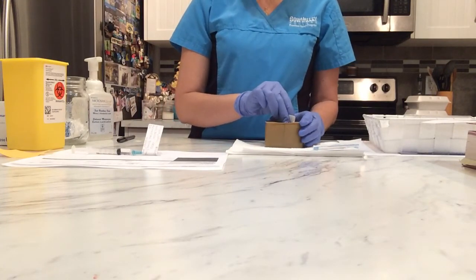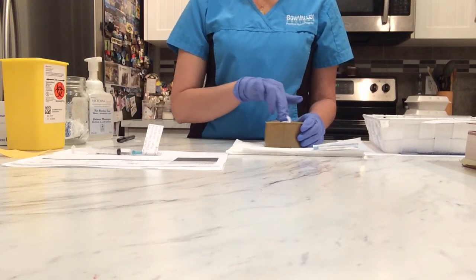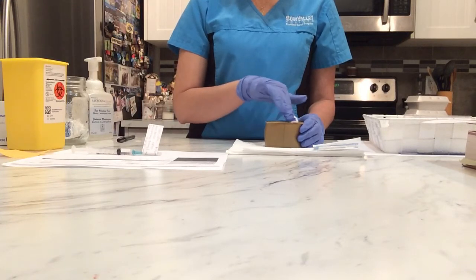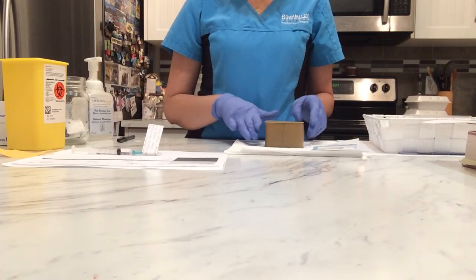So I'm going to start from the center, and I'm going to clean the site for 30 seconds. And I will let it dry.